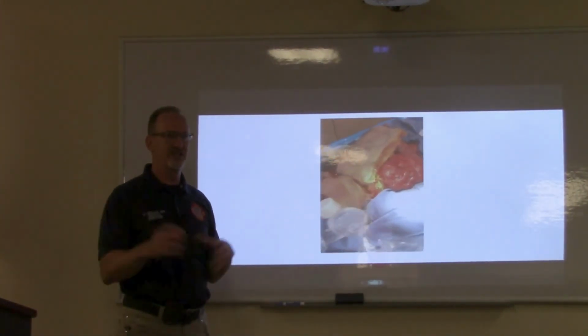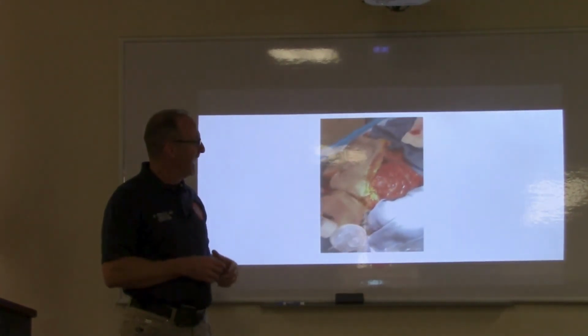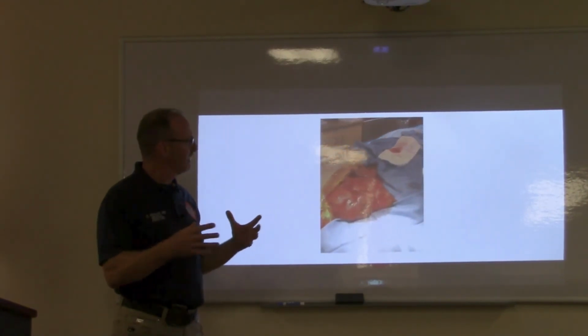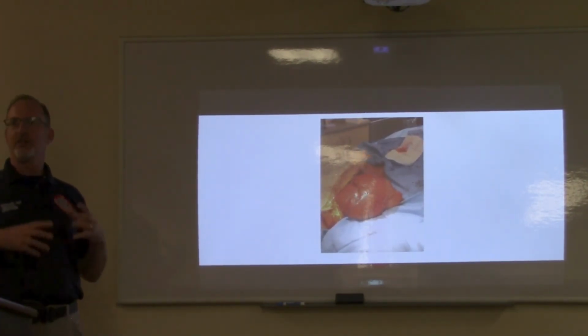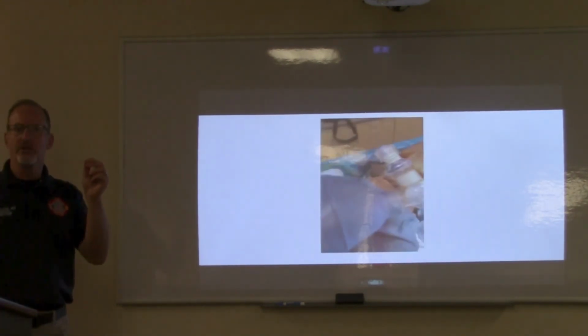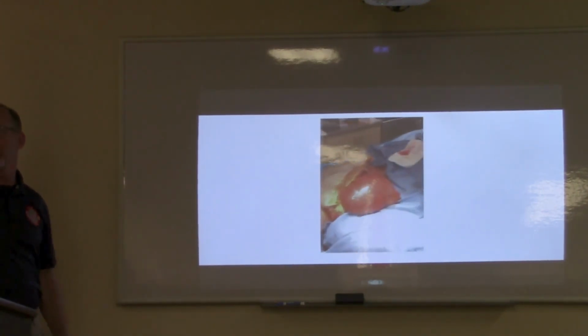Every time you breathe, it just kind of goes back down. When we add the PEEP valve, and now we ventilate, each breath you'll start seeing it a little more open, a little more open. That is the term that you hear for recruitment. With each breath, with PEEP, we're opening up more and more of these little alveoli. That's what PEEP is doing inside your chest.